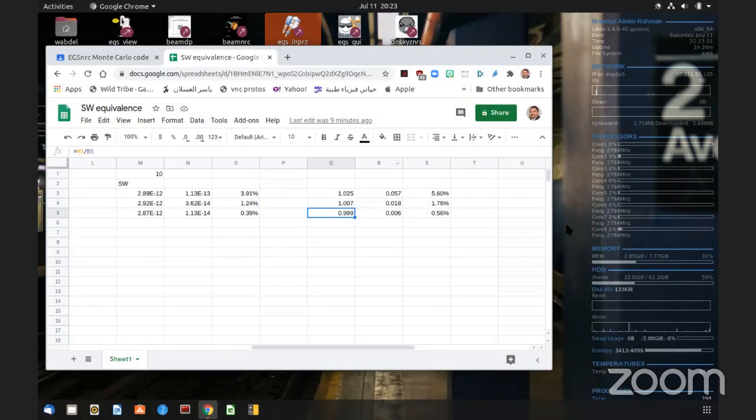Okay. By this method, can we calculate water equivalence of shielding? Look, shielding. You could. I don't see why not. But the problem is, in our situation, we had water surrounded by solid water. Now, when we have this shielding material, is this solid water or water in a phantom surrounded by copper, for example? I don't think so.